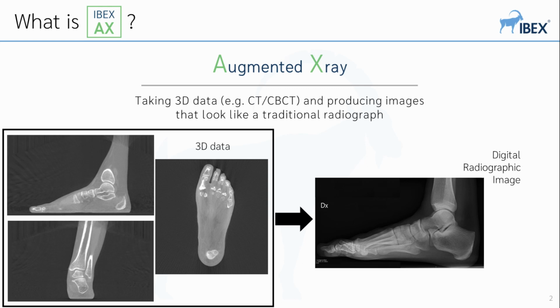Essentially, AX can be considered to be an advanced visualization tool for 3D data. I would also like to point out that although the example given on this slide and throughout much of the presentation will be of feet, the technology is general and works on all anatomies.